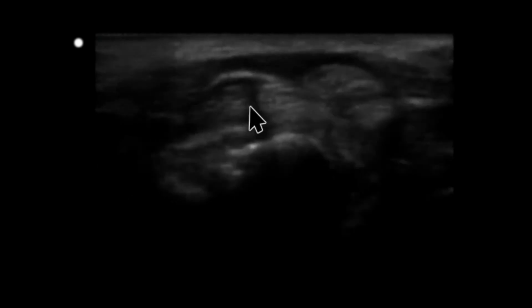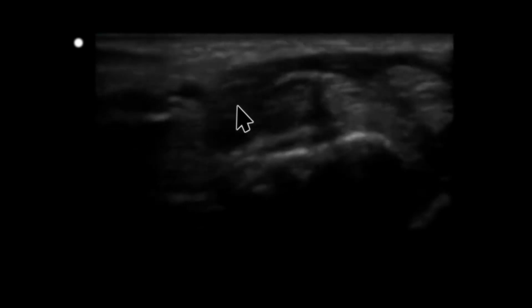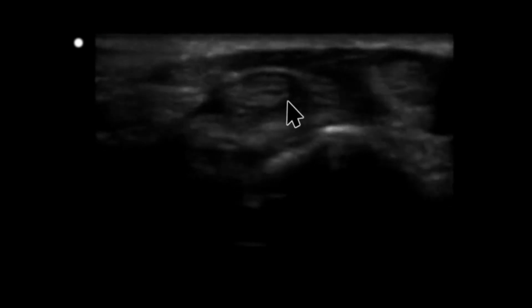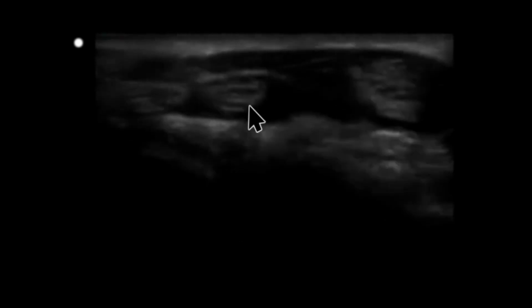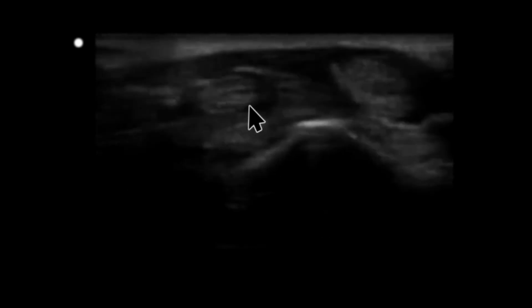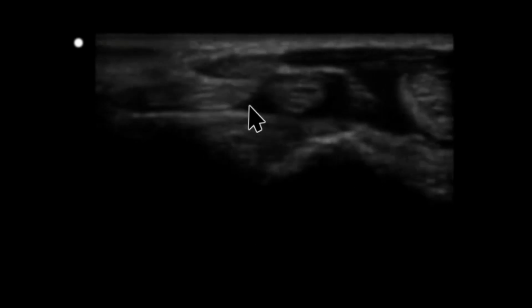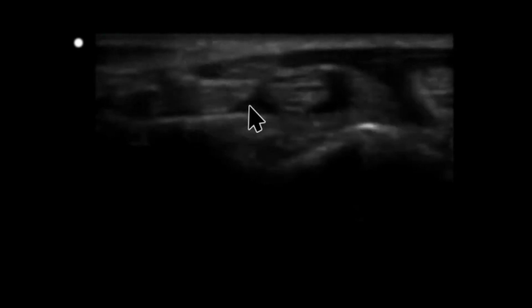Here, one can see tendinosynovitis in the wrist in the short axis. One can see the tendon seen here in the short axis, and there's a lot of fluid surrounding this tendon seen here and here. There should not be any fluid around this tendon. The tendon should be directly adjacent to its respective tendon sheath. Instead, there is fluid causing thickening of the tendon sheath.